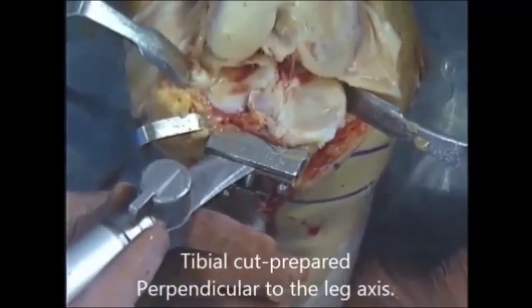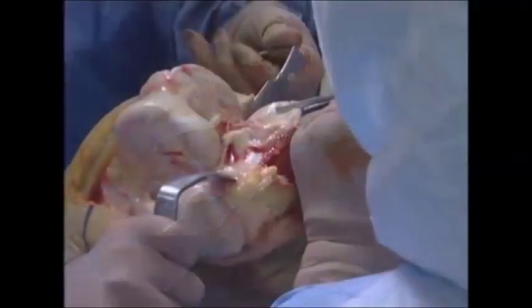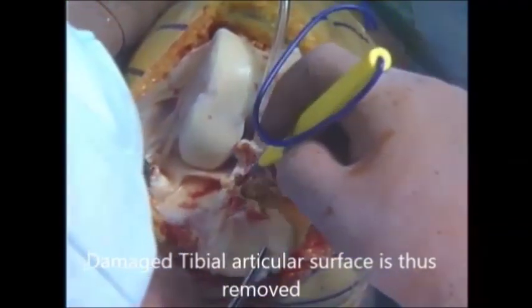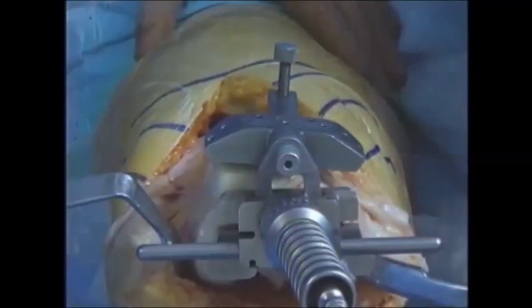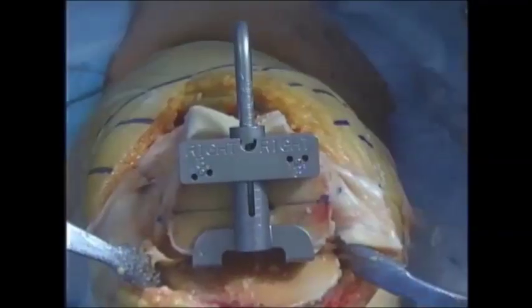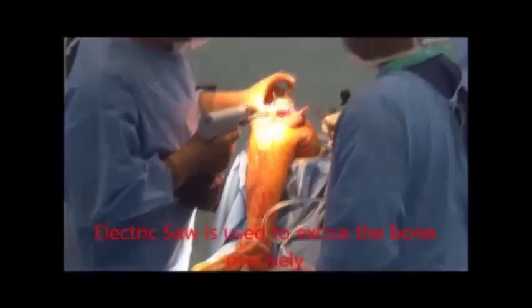Next, the tibial portion of the knee joint, for example, the cartilage and the bone beneath it, is removed, which is more or less 10 mm thickness, which will be replaced by roughly the same size of the tibial implants. In this endeavor of removing the bone, the electric bone saw is used to remove the bone precisely. Similarly, the femoral portion of the joint is cut and reshaped using the various femoral guides and the electric bone saw.